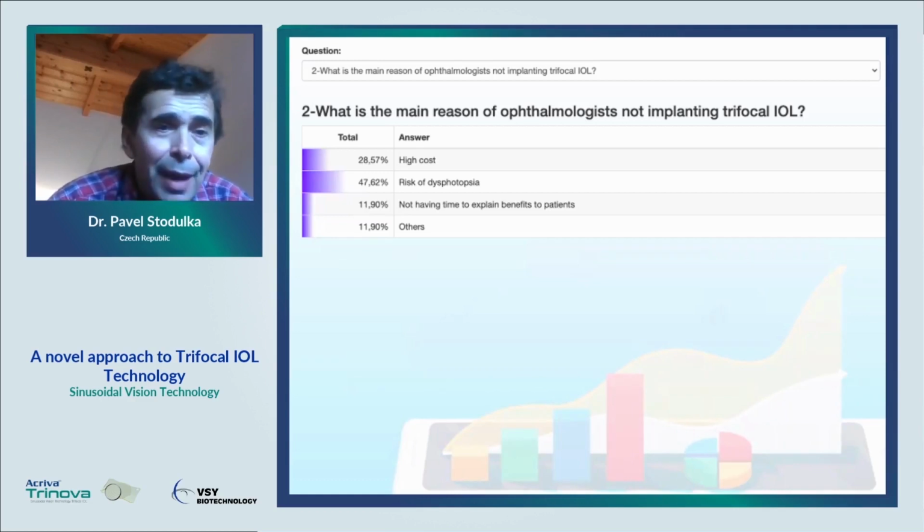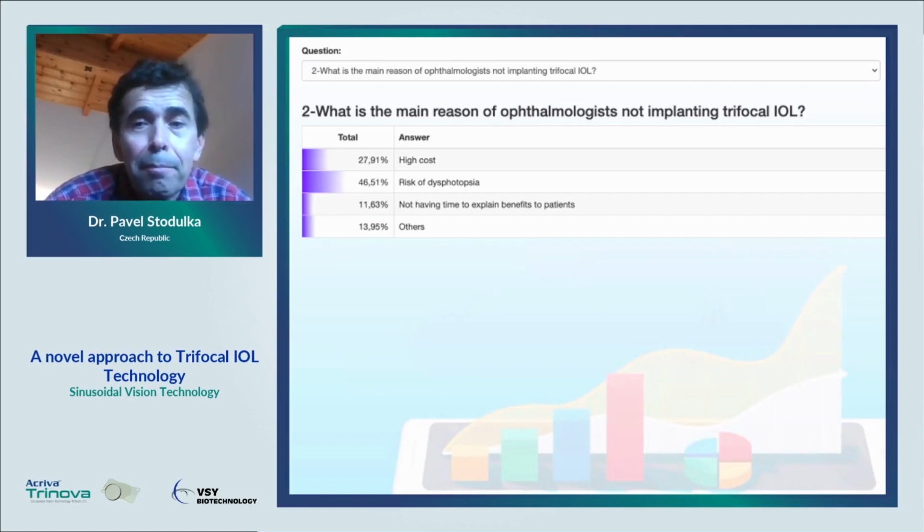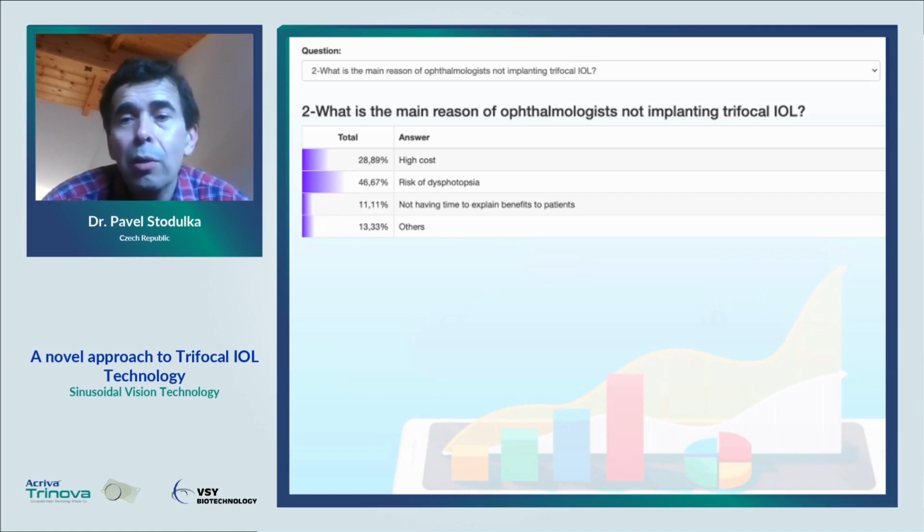Yeah, I didn't guess here, but I think that's the main reason why many surgeons are afraid to use trifocal lenses in general. So they select the patients carefully, or they do not implant trifocal lenses, as 40% of the attendees today said at the first question. So risk of dysphotopsia. I think that's again the topic for Florian to explain the optical principles, and then Naris will get us through the clinical results, because we of course need to understand the technical and optical principles, why certain trifocal IOLs have a lower dysphotopsia rate. But on the other side, we do need to confirm the theoretical information by clinical results. And that's how we physicians should work in clinical practice.